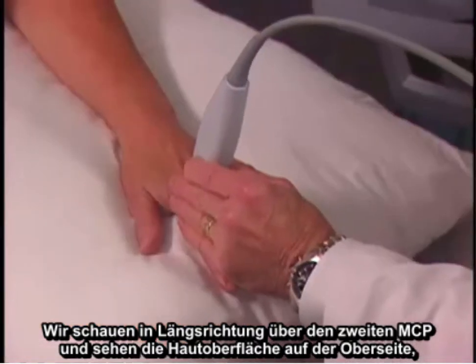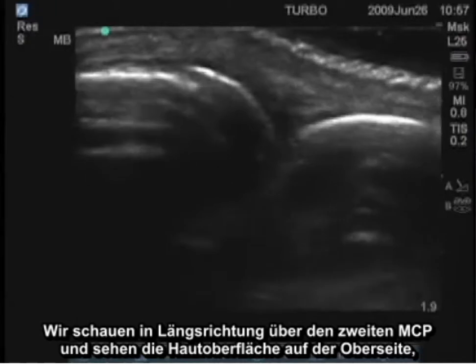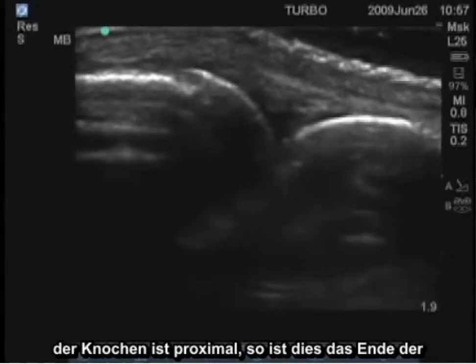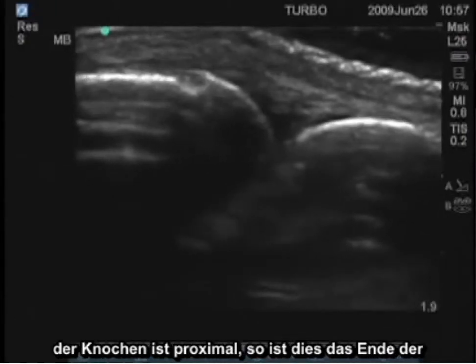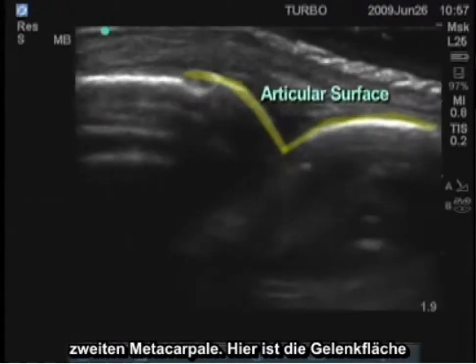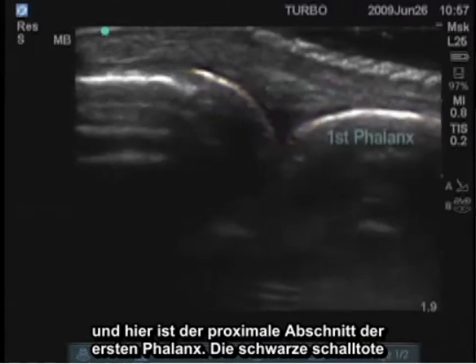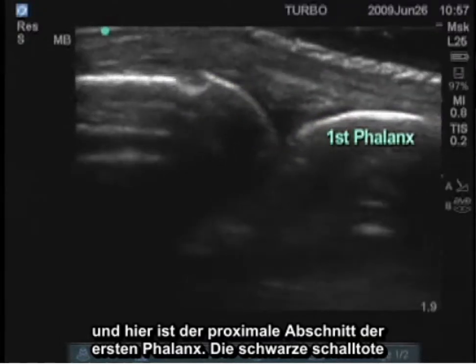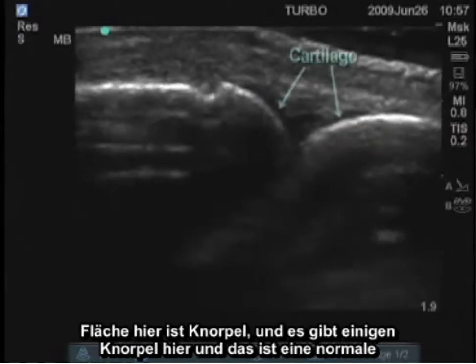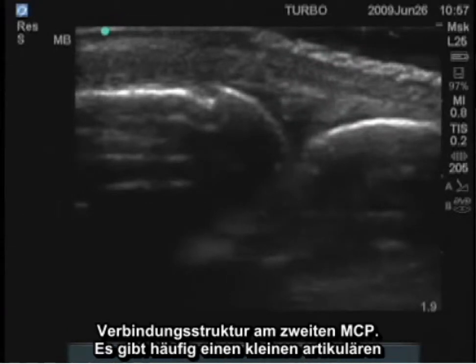We'll look longitudinally over the second MCP first, and see the skin surface on the top, the bones — this is proximal, so this is the end of the second metacarpal. Here's the articular surface, and then here is the proximal portion of the first phalanx. The black anechoic surface here is cartilage, and this is a normal joint structure at the second MCP.